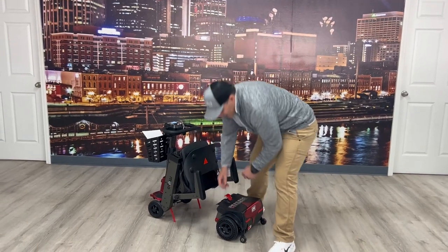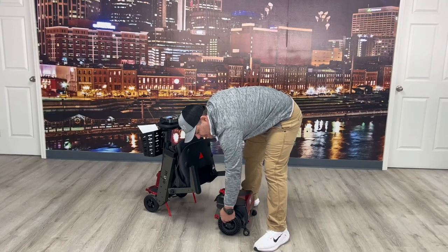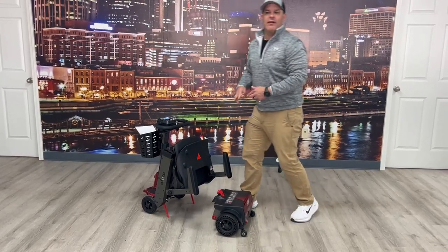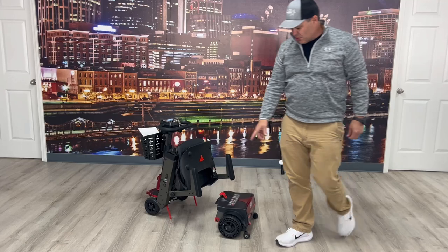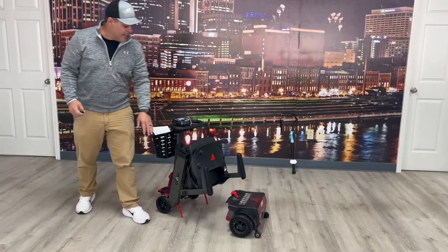The other thing I like are the tires — I think the way they describe them is a honeycomb tire, so you don't have to worry about getting a flat tire. I think these are seven inches on the back and six inches on the front.